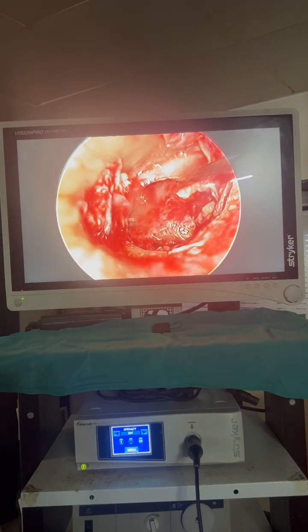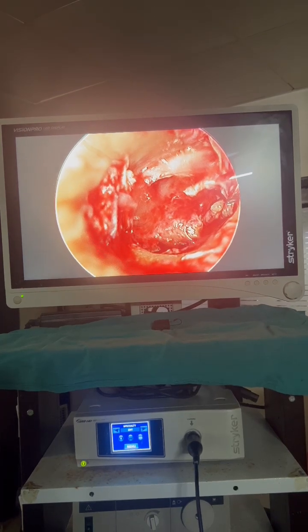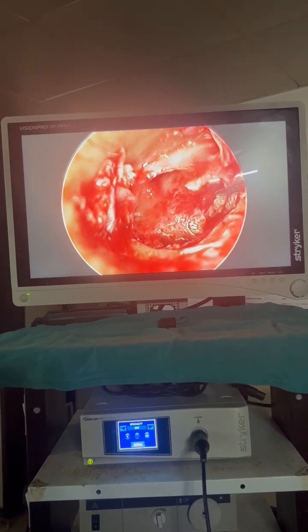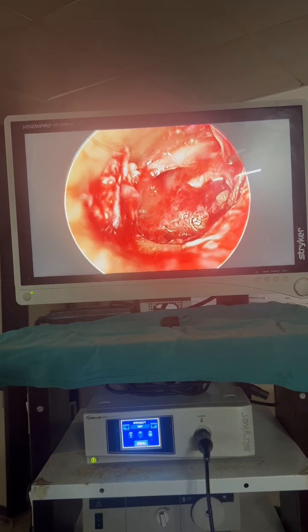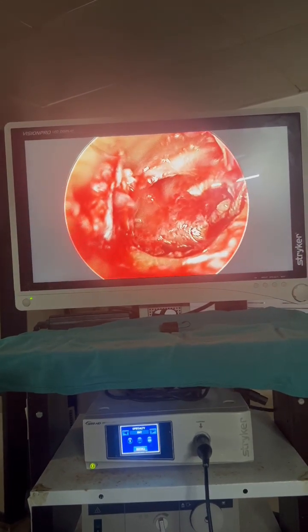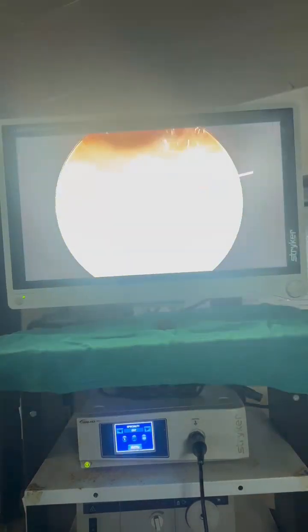This is the anterior tympanic isthmus, and that small area between the short process of the incus, or posterior incudal ligament, and the stapedius or pyramidal eminence is the posterior tympanic isthmus. So that is how the epitympanum is aerated from the mesotympanum. There is another space, the Prussak space, which you are not able to see, which is in the epitympanum. Thank you.